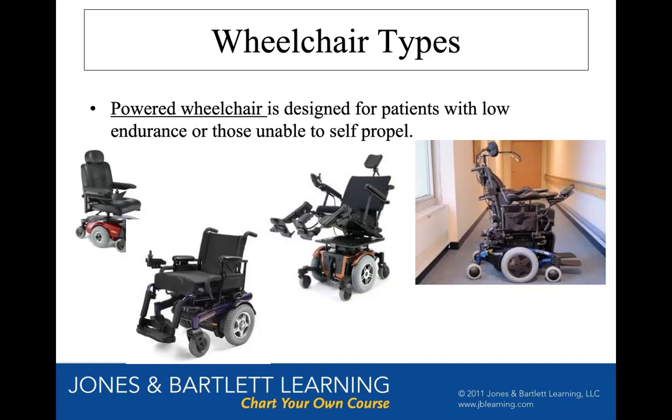But the people that get it and get good at it, once you try to give them a different way to do it, say, hey, you want to use a joystick, they don't want to do it any other way. They get stuck in their ways and they want to keep sip and puff forever. So once they learn it, they like it and they never want to do anything else.